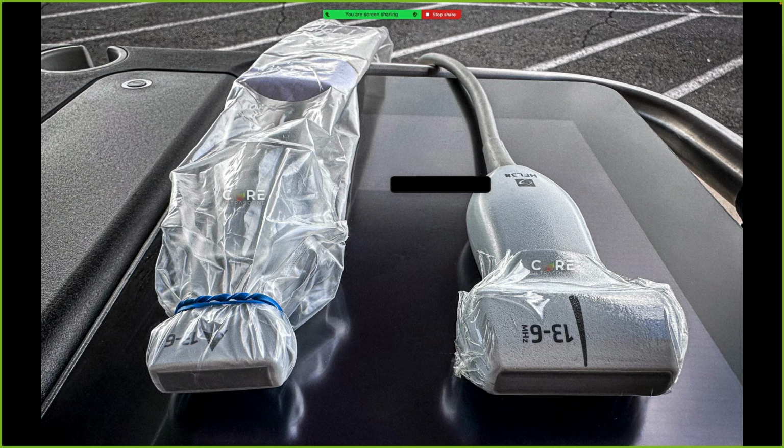The issue with not using the Tegaderm with everything is, when you look at the data, technically there are very small virions that on average are smaller than the pore size of the Tegaderm. So there is a theoretical risk that hepatitis B is one of them, that hepatitis B might be transmitted if you had it on the probe and didn't clean it and then just put a Tegaderm on. It could be transmitted, especially if you're central or near a mucous membrane, but it's never been reported. It's literally never been reported. And we're cleaning the transducer before we put the Tegaderm on.